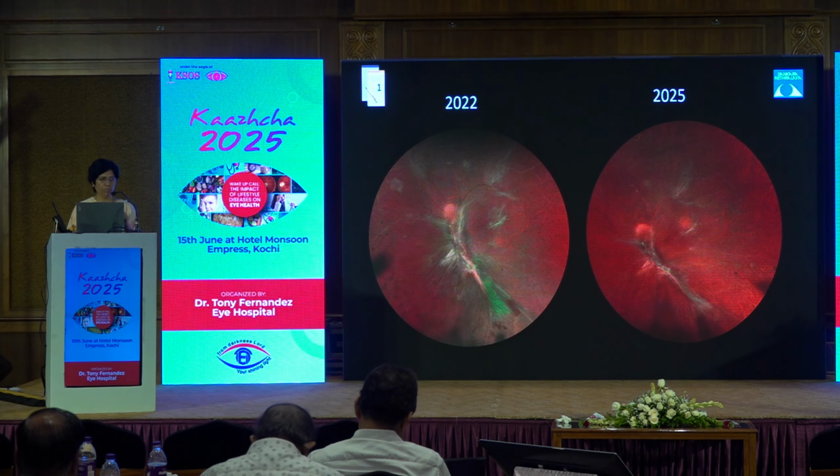What will happen is during your surgery, the macula is going to get detached because of your manipulations, and sometimes the membranes will be so adherent that it will cause traction on the macula. Once the macula gets detached, whatever you do, even with successful surgery, the post-surgical visual outcome is going to be lesser than pre-operative. So this will result in a very unhappy patient.